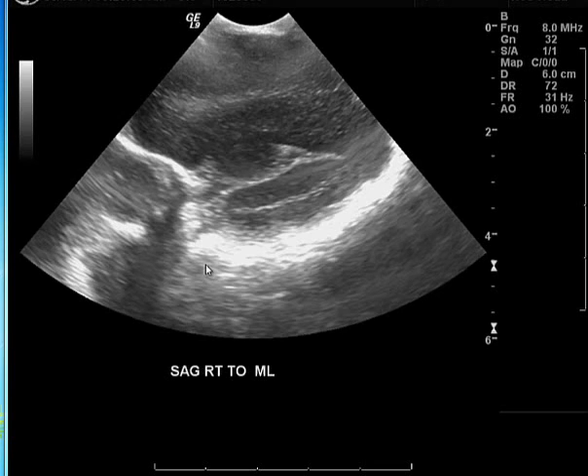Following this, the images change to the sagittal plane. We move from the right parasagittal plane toward the midline, then from the midline toward the left parasagittal plane — you simply turn the probe to obtain the sagittal and parasagittal images. To orient yourself: the anterior aspect of the brain is here, the posterior aspect here, the right lateral aspect includes the temporal lobe, and the frontal and parietal lobes are seen here, though the distinction between them is hard to make out on ultrasound.